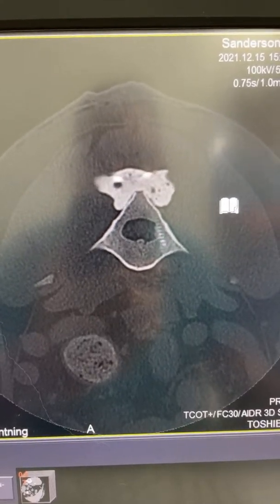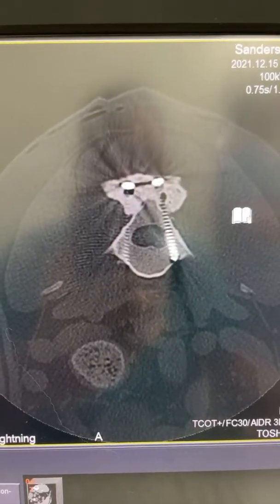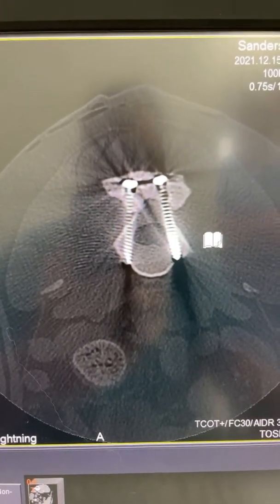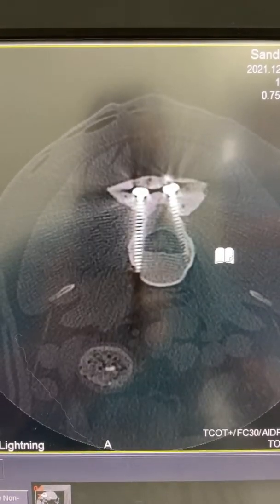Heading caudal, you can see the first two screws right there. You can see that one of the screws is just glancing on the side of the spinal canal. Certainly no concern there with respect to impingement of nerve roots or anything like that.